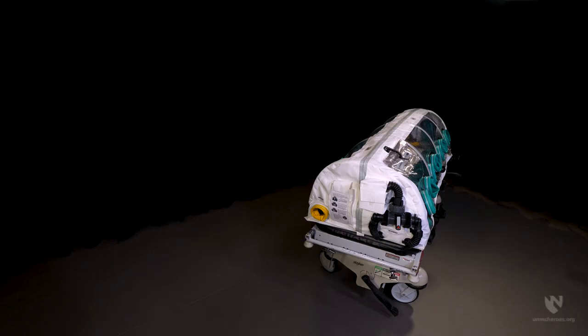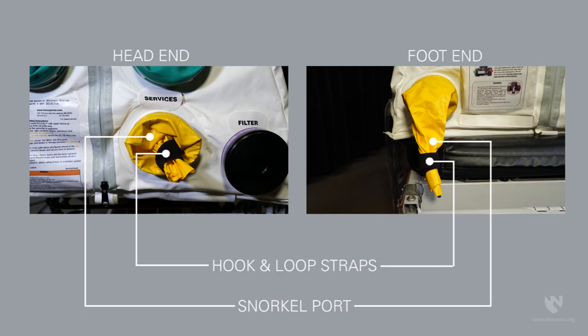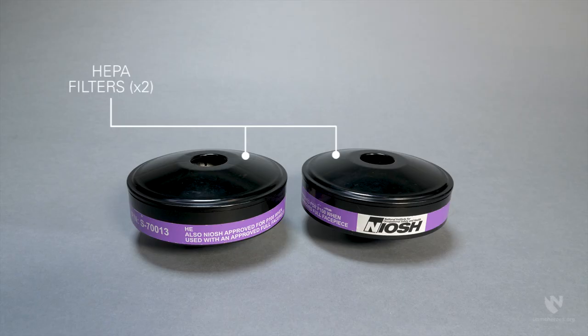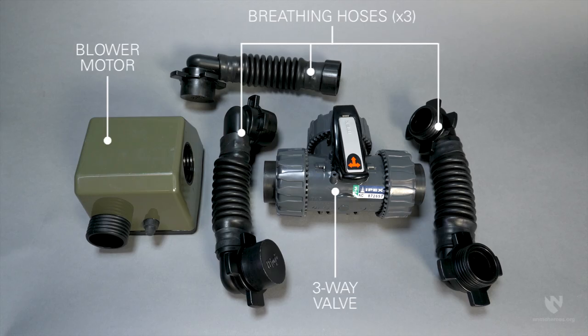The AirBoss ChemBio isopod is equipped with the following features: the isopod enclosure, a pillow, two snorkel ports with hook and loop straps — one at each end of the enclosure, two HEPA filters for mounting to the exterior, two HEPA OVAG filters for mounting in the interior, a blower motor, three breathing hoses, and a three-way valve.